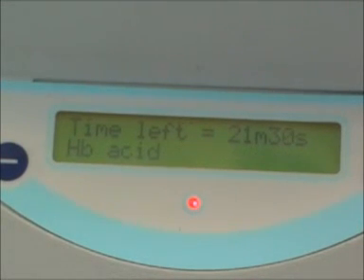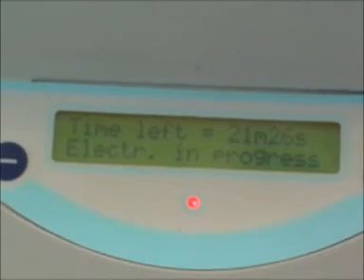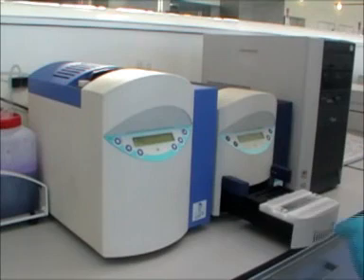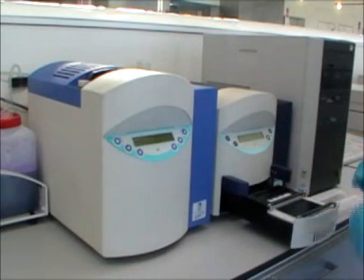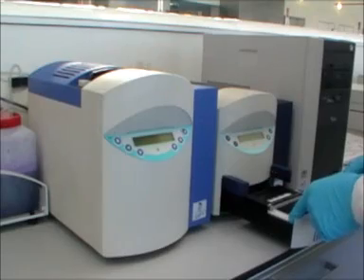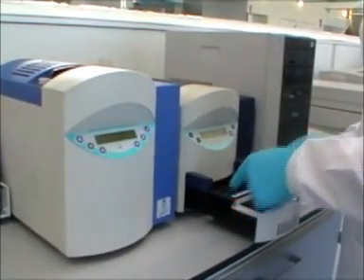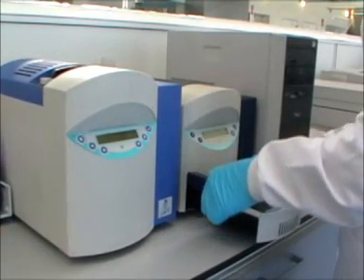At the end of the electrophoretic run, the display indicates that the run is finished. The gel drawer is opened and the gel cover and carbon electrode rods are removed, together with the sample tray.